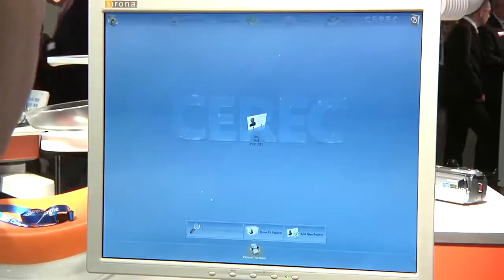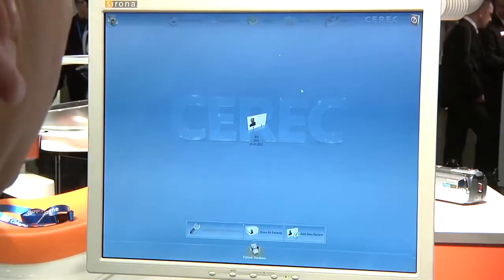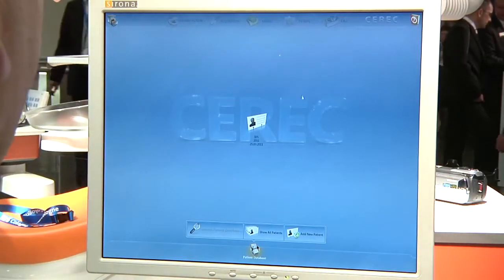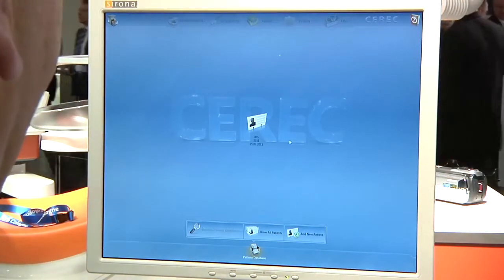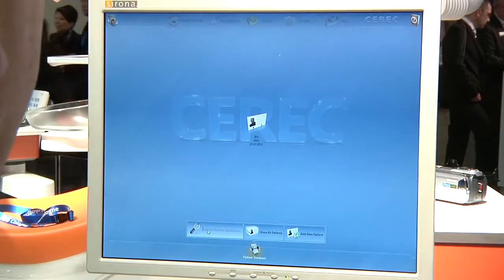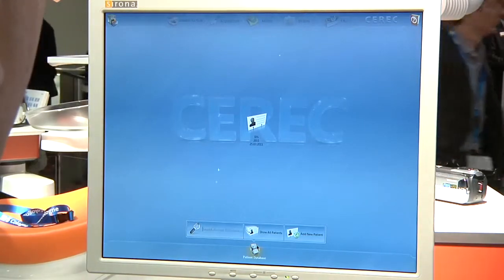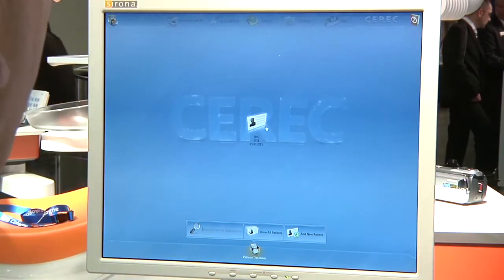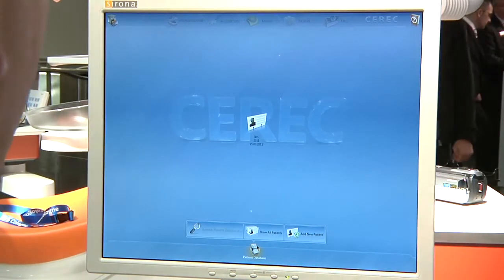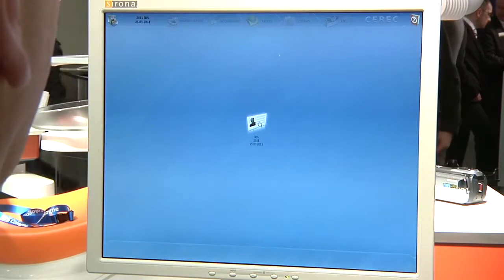First thing, if you notice, just a totally new outlook here. To me, it looks much cleaner. Down here, as we did before, we can put in a database. We can start typing a patient's name and our names would come up, or you can show all patients or add new patients — this is all in administration. I'm going to pick our IDS patient here this morning.